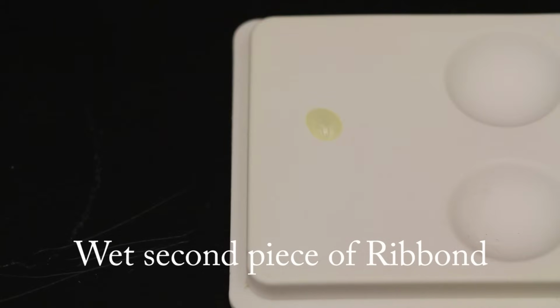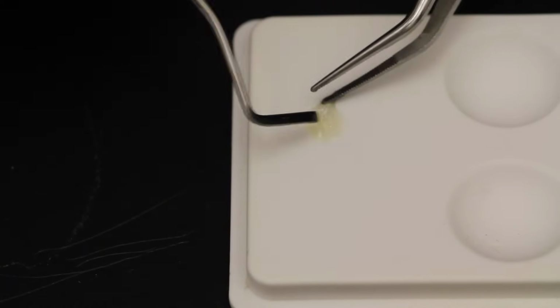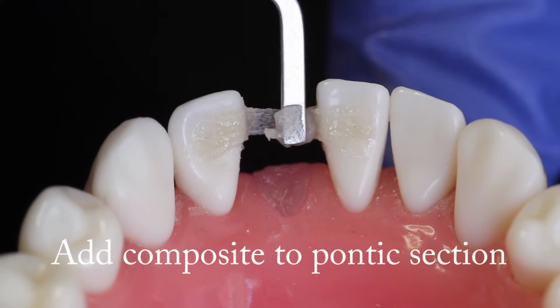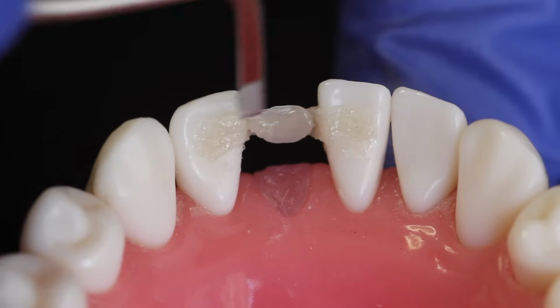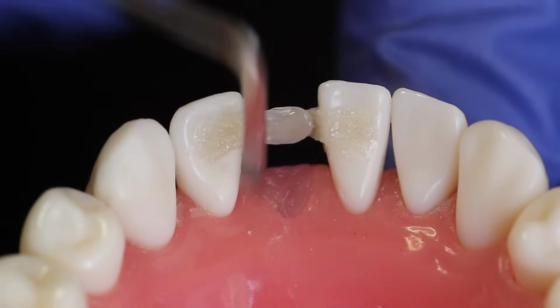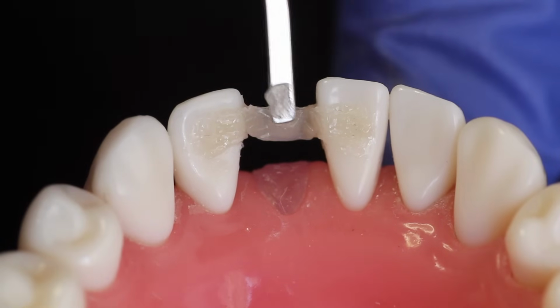Wet the second piece of ribbon with a bonding adhesive that does not contain a dentin primer or acid etchant. Place a thin layer of the same filled composite that we used earlier for the procedure on the lingual side of the ribbon in the edentulous area. Extend this composite layer onto the interproximal angles of both abutments.